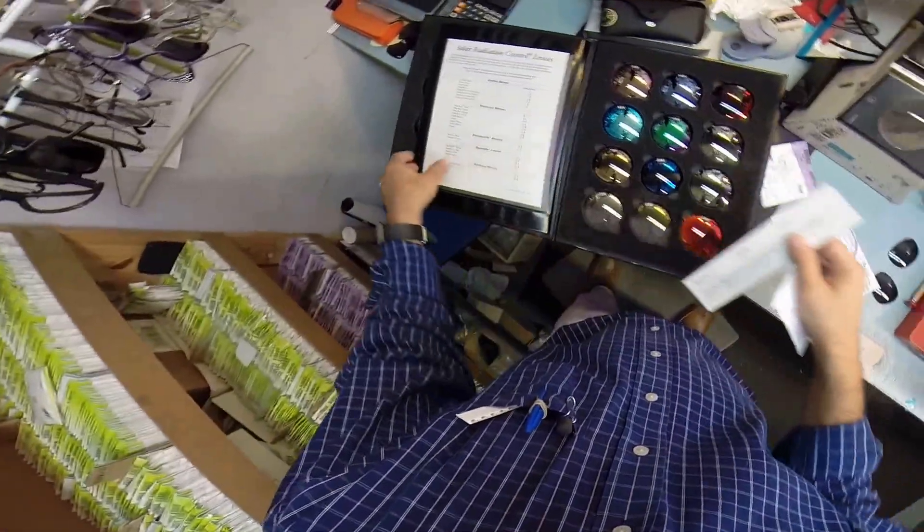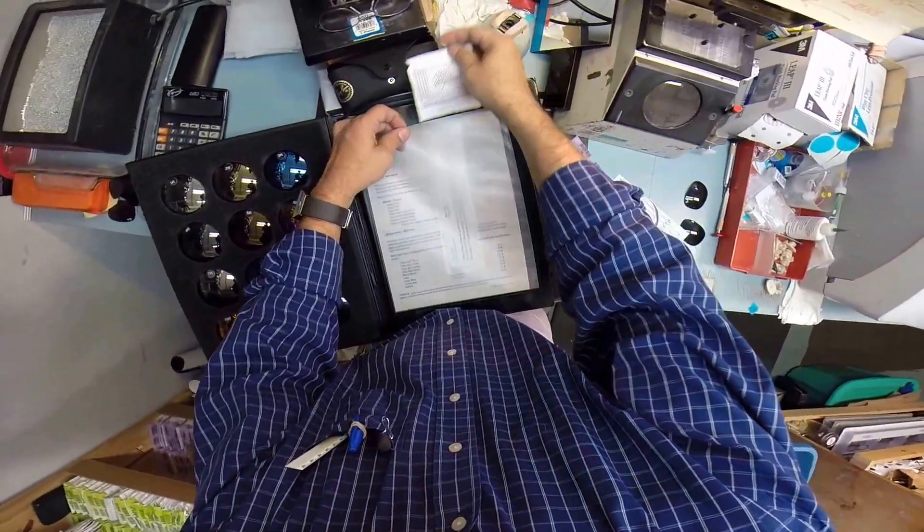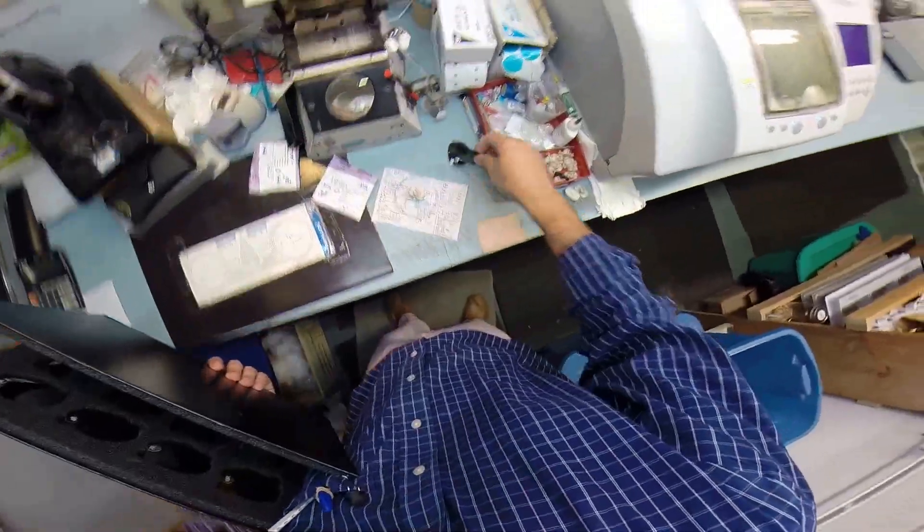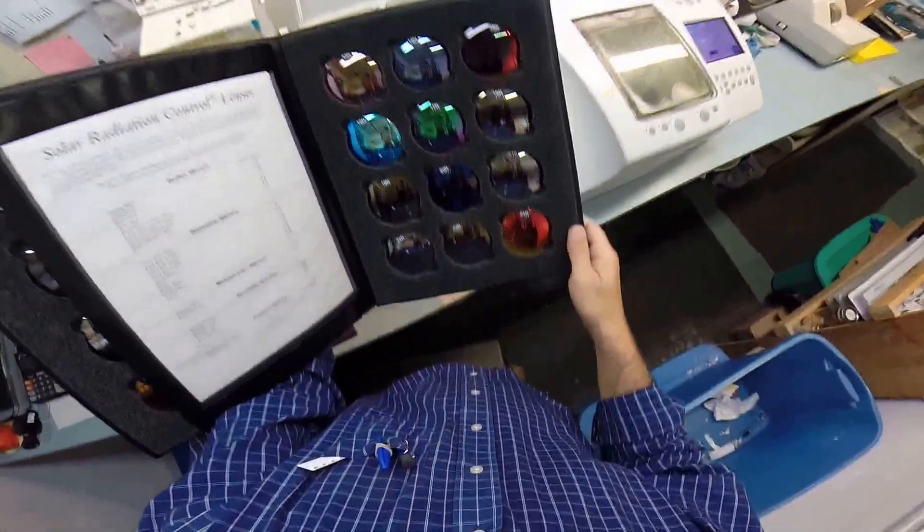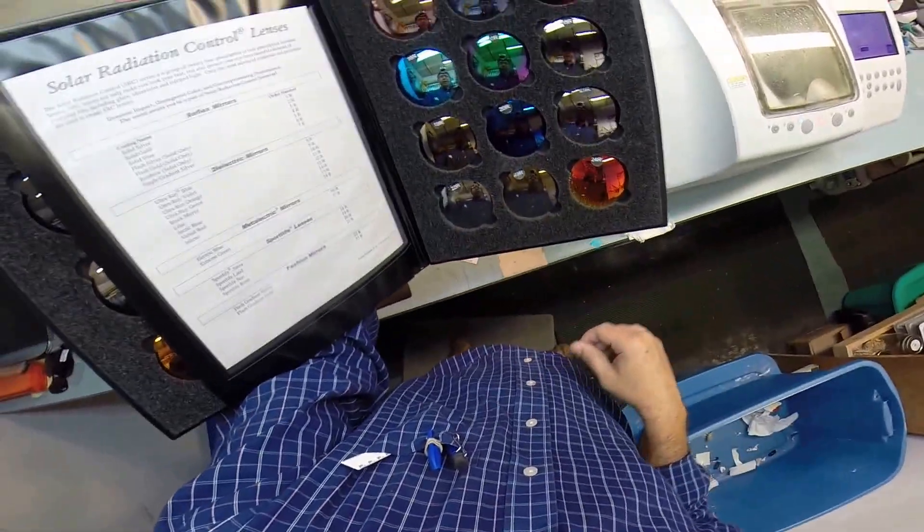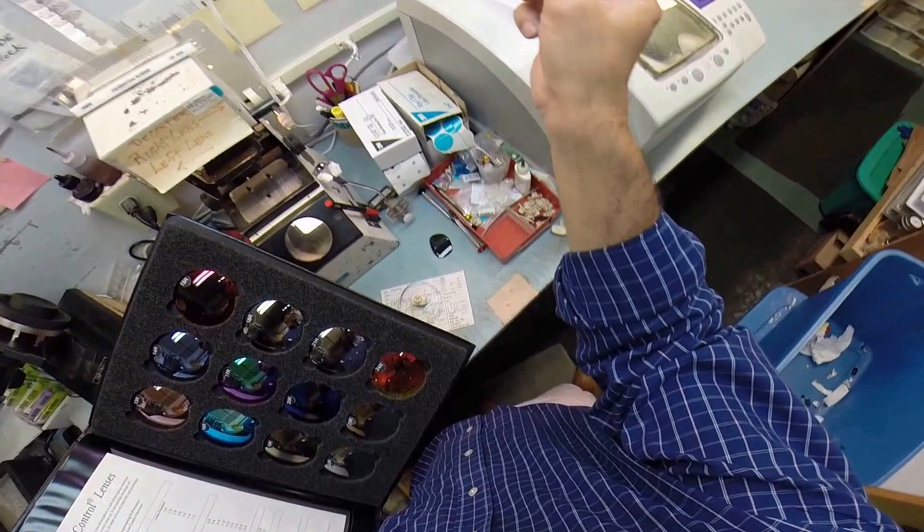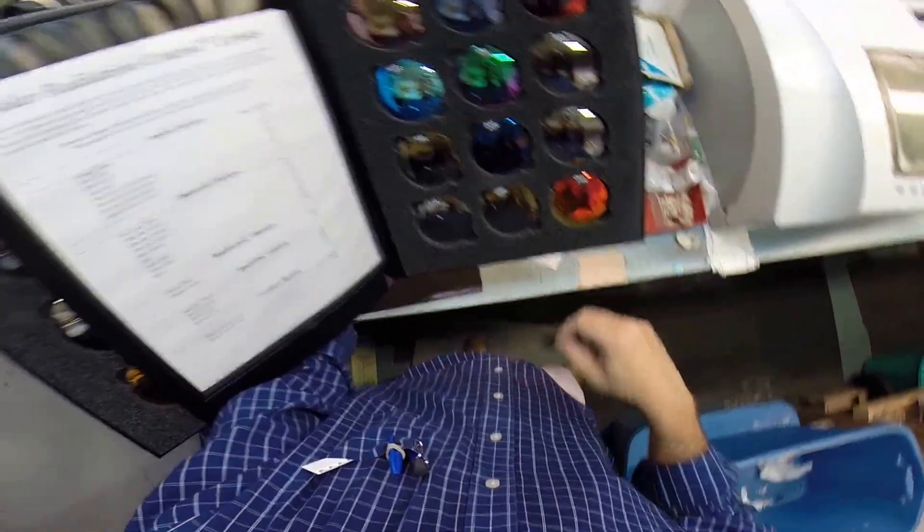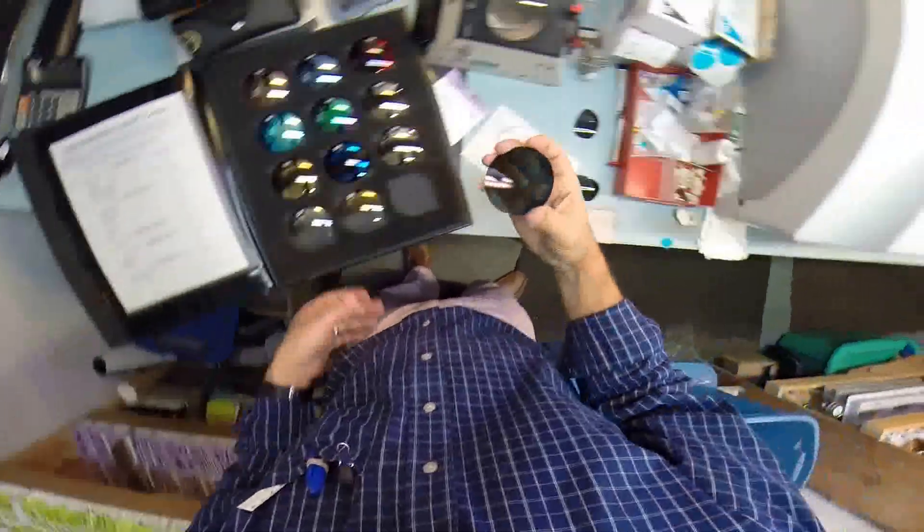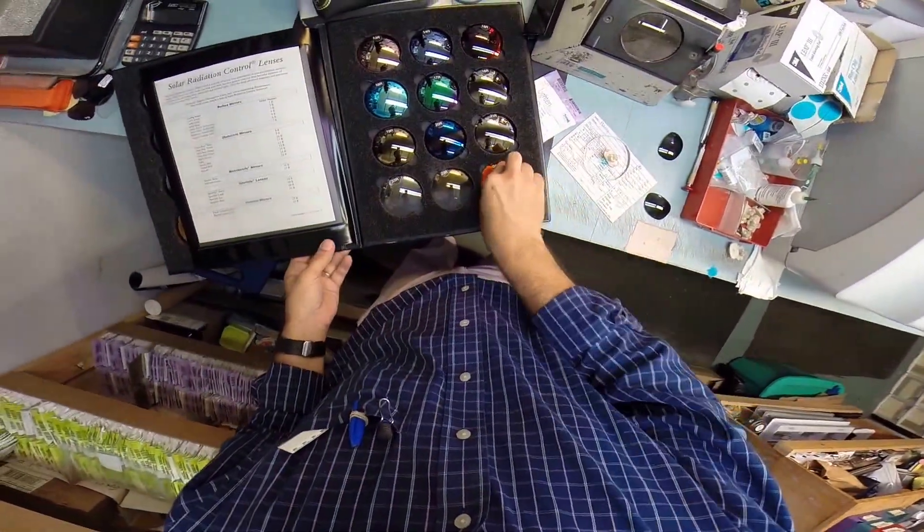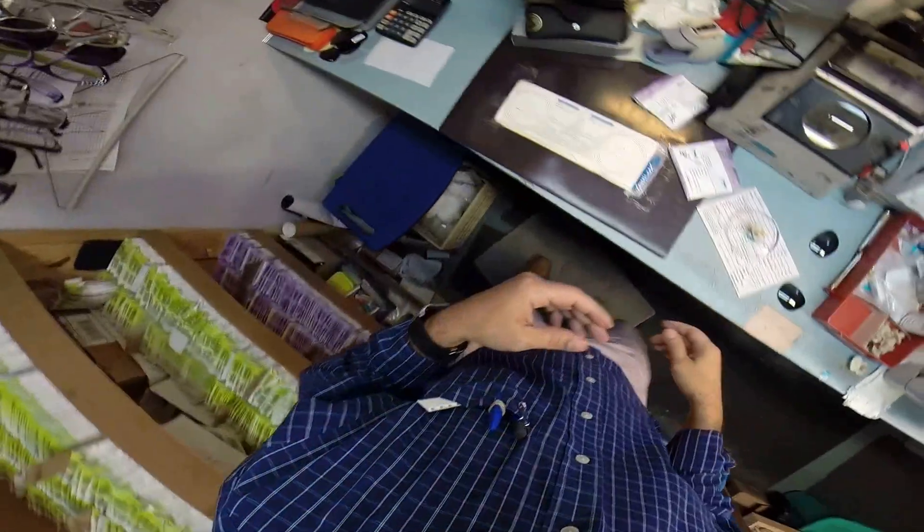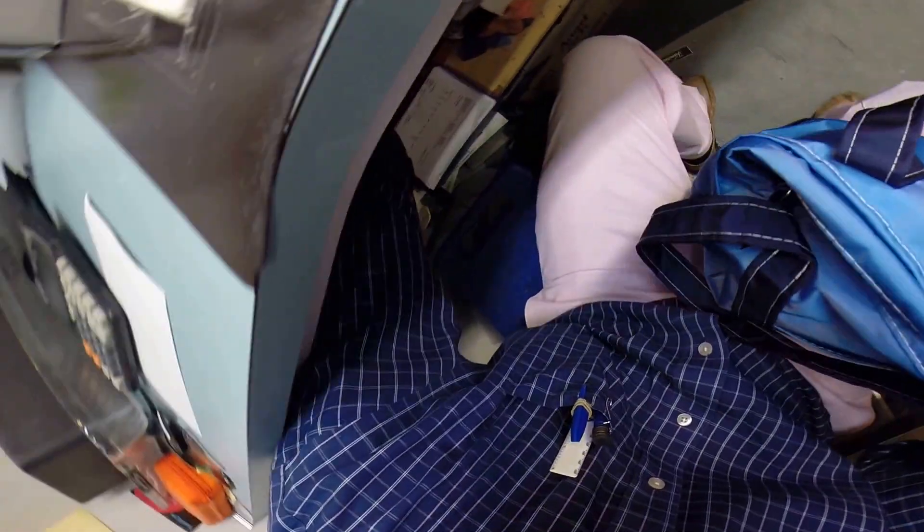So I can cut them to go over anything. And again, you have a choice. What you do is you pick a polarized lens color preference that you look through, such as a gray, a brown, or the classic Ray-Ban G15, which is what comes in here. That's a gray green lens versus a solid gray. And then you can pick any color coating to go on top of that. So you can have a gray lens with a red coating. You could have a brown lens with a blue coating. It's just when you look out of the lens, you'll see whatever color that you have chosen. And when people are looking at you, they will see this color. In fact, if I pull this red out, let's see what the background color is. It looks like a gray. So when you look through here, everything is gray. But when people look at you, they see the red. That's how it works. And I know you wanted two different colors of red.